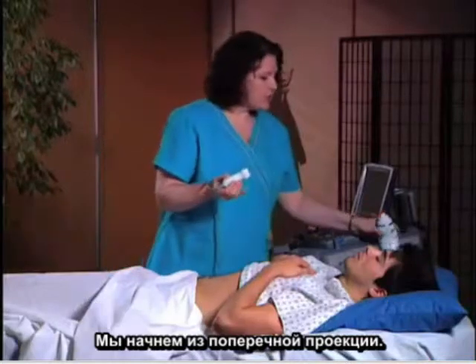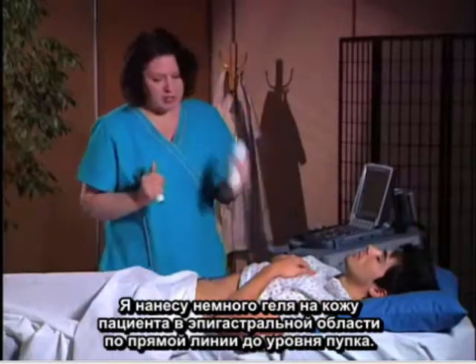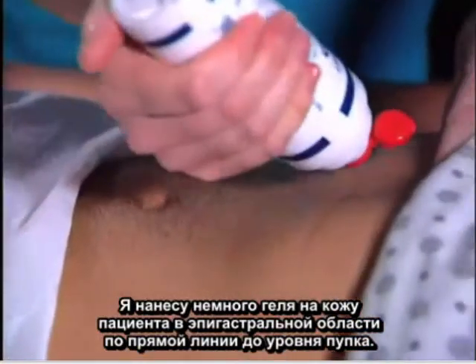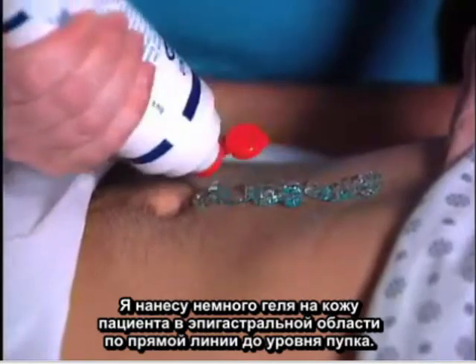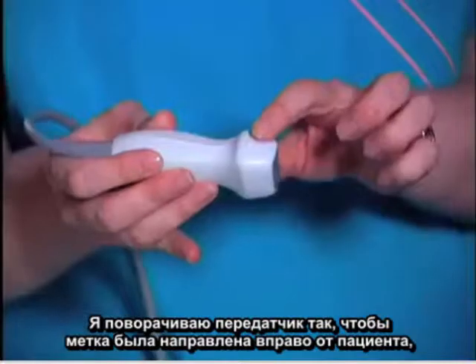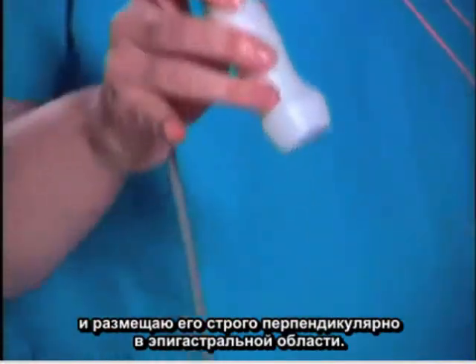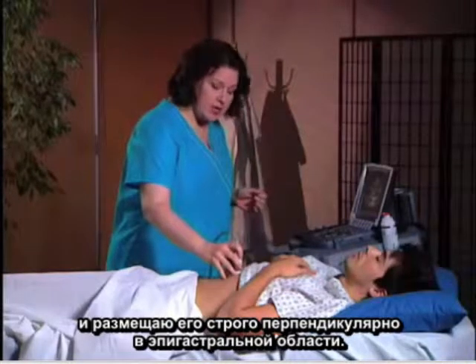We're going to start in a transverse view. I'm going to put some gel on the patient from the epigastric area to the level of the umbilicus in a straight line. I'm going to orient the transducer so the marker is to the patient's right, and I'm going to place it straight up and down in the epigastric area.